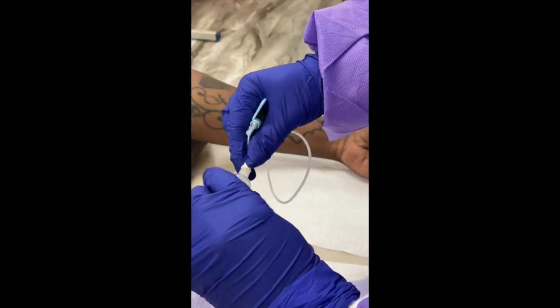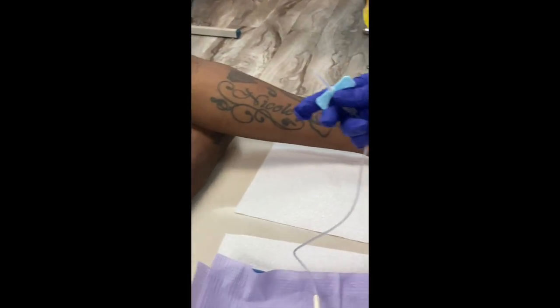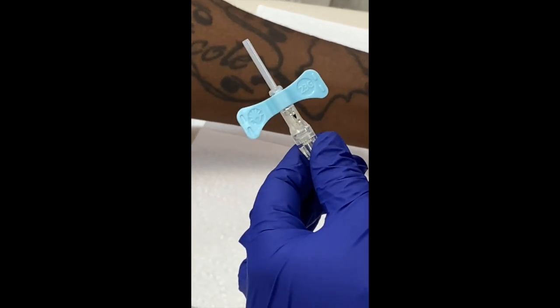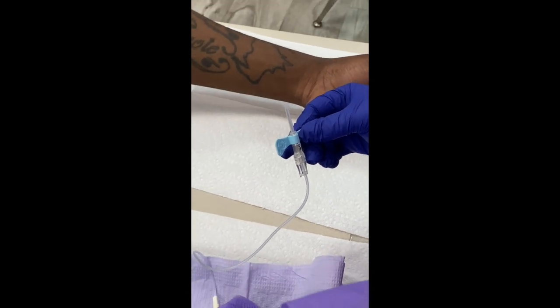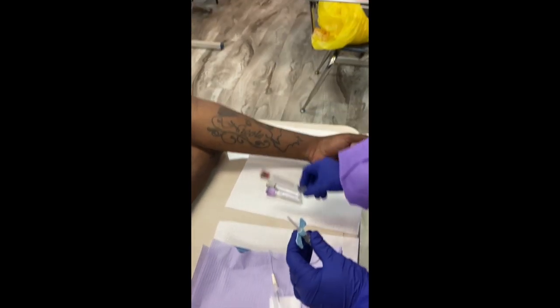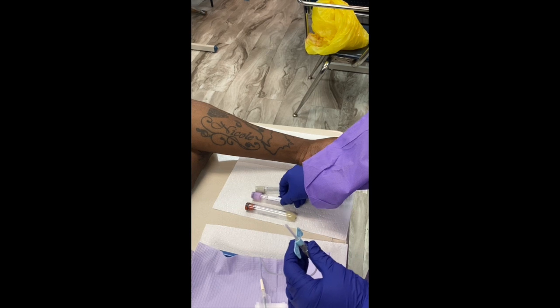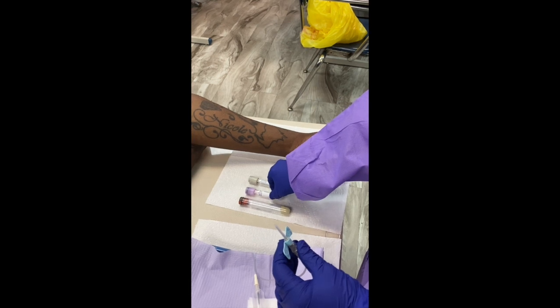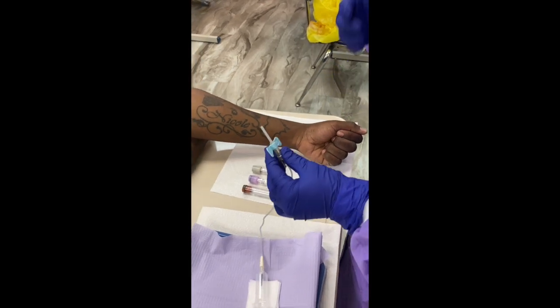I'm going to make sure I get the hub and the end of my butterfly on nice and snug, because sometimes when it comes from the factory it's nice and loose. You see that little arrow on the butterfly — after you're done, you want to push that because that is your safety button, and that's how you retract the needle. I'm going to have my tiger top tube, which is the order of draw, then my lavender tube for hematology, and then a gray tube — maybe for glucose or lactic acid. In case it's a glucose, I'm going to ask if the patient has been fasting for eight or twelve hours.